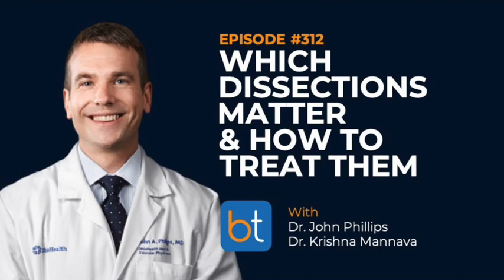Before you reach for whether it's a stent or a tack, are there certain things you do to limit or avoid dissections altogether that you've found over experience? Yeah, well, number one, let's talk about the tibials here. I think we undersize our balloons in the tibials. We know on average a tibial is probably about 2.6 millimeters, taking all comers. But people typically grab a half size lower than that because they are worried about dissection, rightfully so. And I'm not saying that we should IVUS every vessel and go really aggressive and try to create dissections and use devices to treat them.